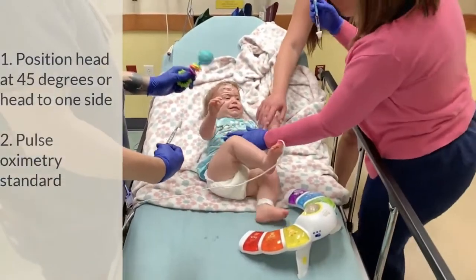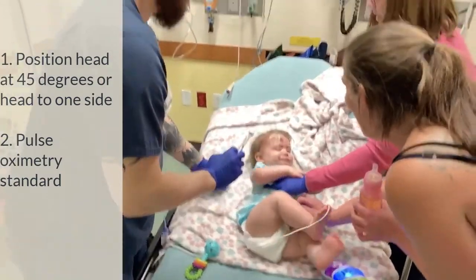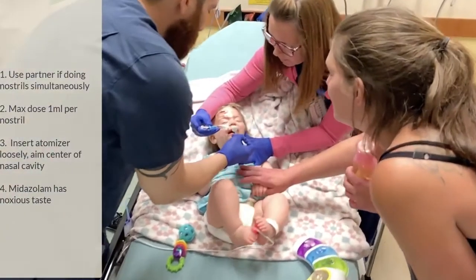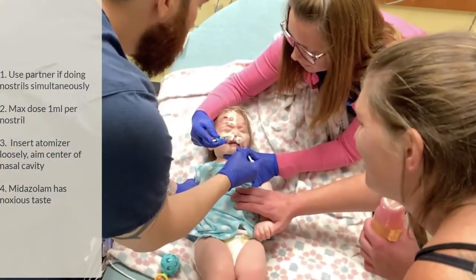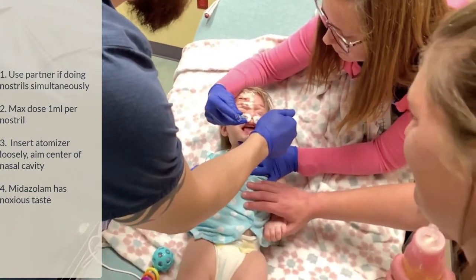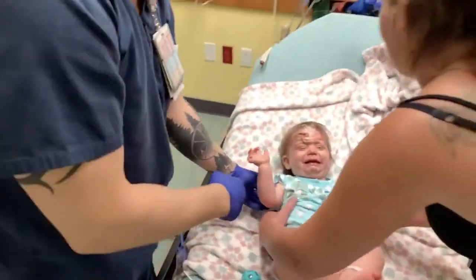So we make sure again that the head of the bed or the head of the baby is at a 45-degree angle. The atomizer is then loosely placed into the nostril and then aimed at the center of the nose and quickly delivered into the nose.